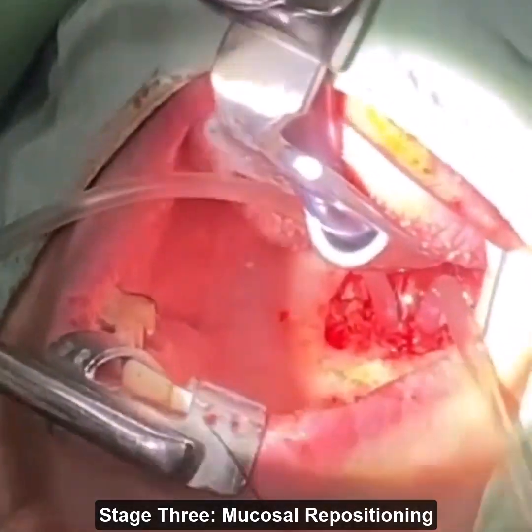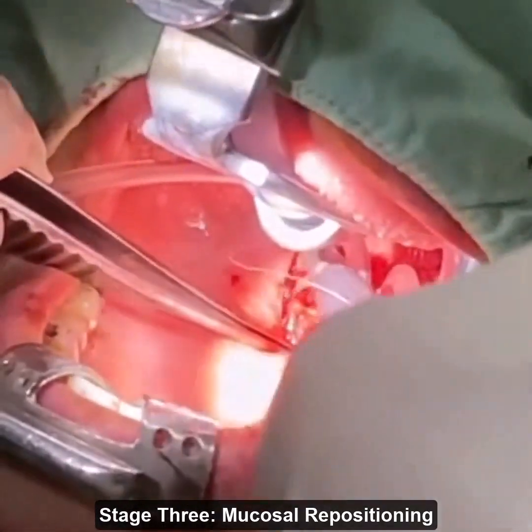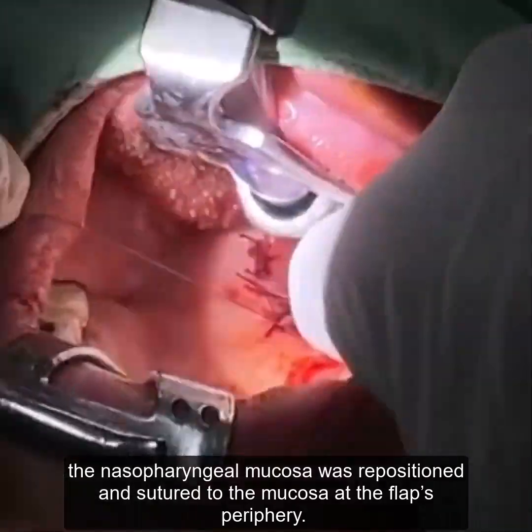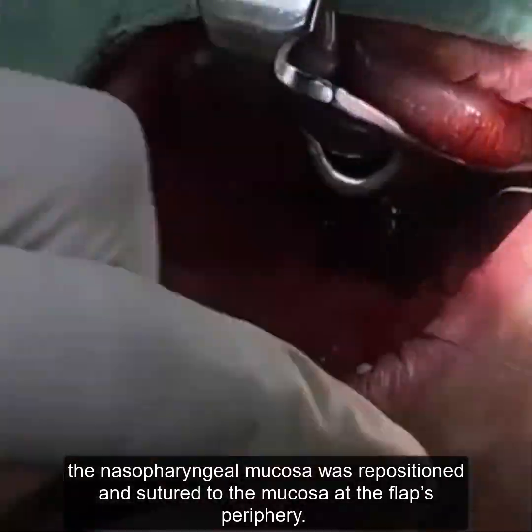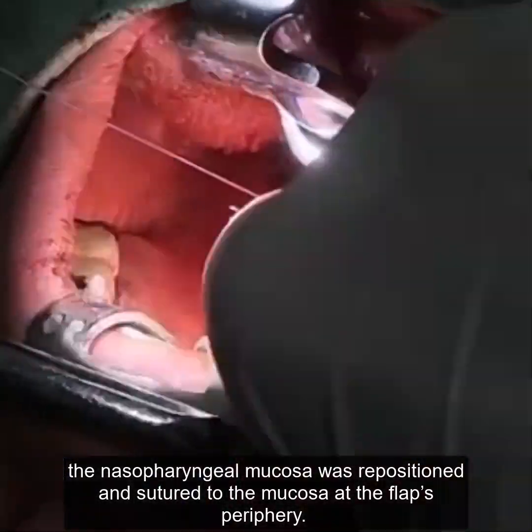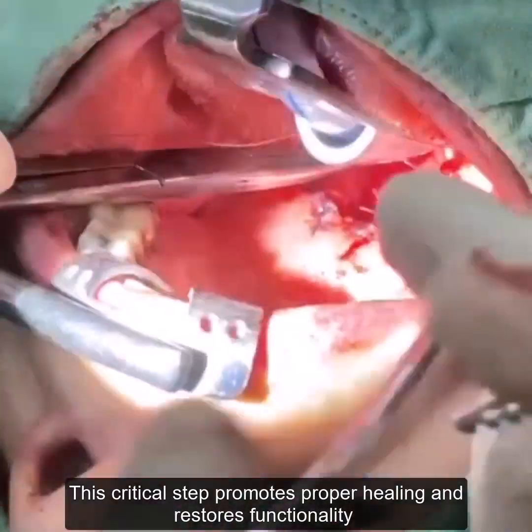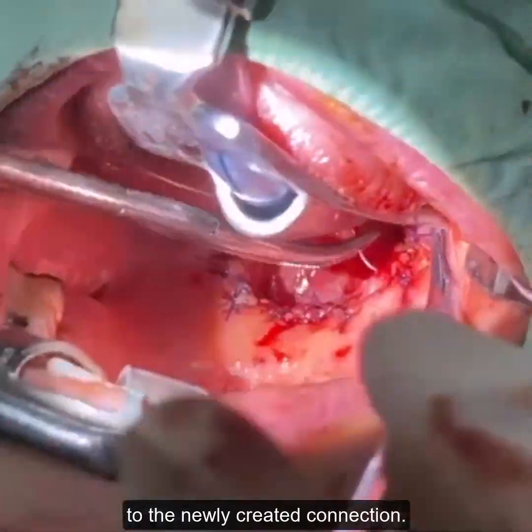Stage 3, Mucosal Repositioning. Once the muscle layers were gathered, the nasopharyngeal mucosa was repositioned and sutured to the mucosa at the flap's periphery. This critical step promotes proper healing and restores functionality to the newly created connection.